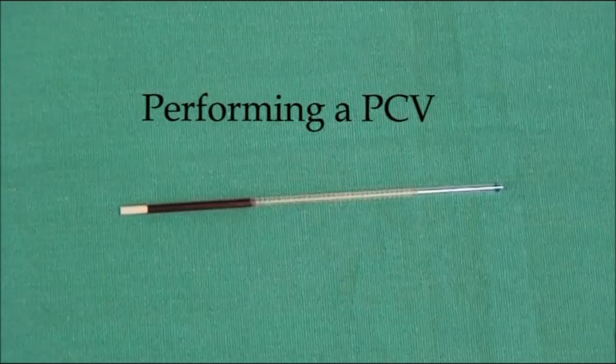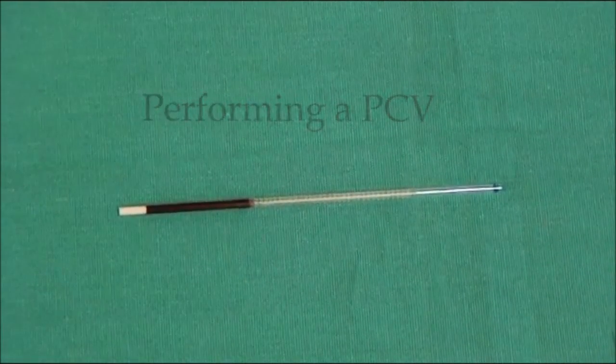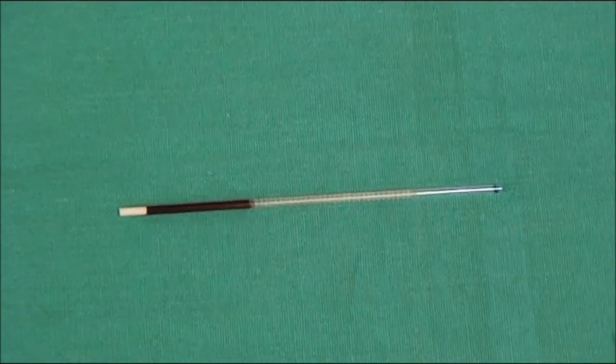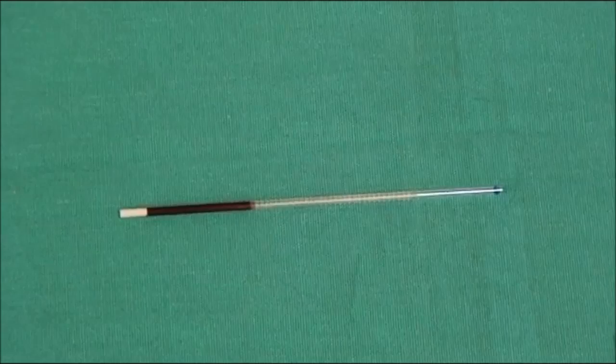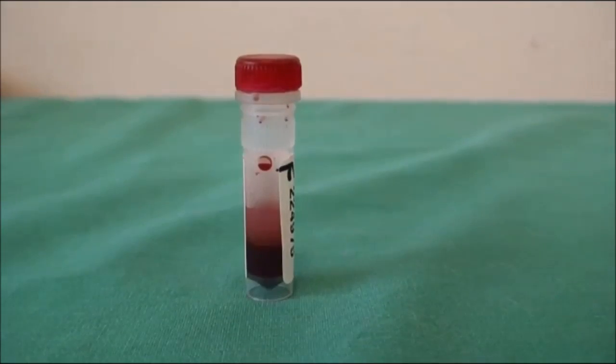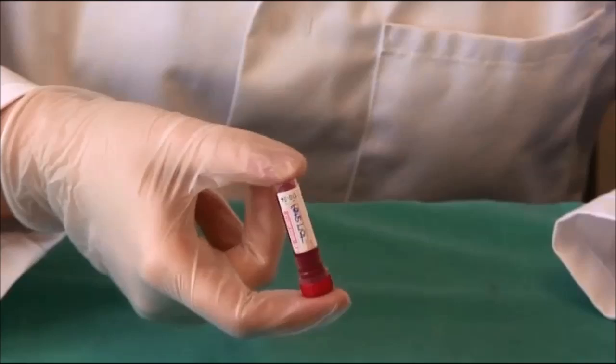A PCV or packed cell volume using the hematocrit method is used to make a rapid assessment of the number of circulating red blood cells. It is safe practice when handling blood to always wear protective gloves. To counteract the fact that blood cells will naturally separate into layers, the EDTA blood sample is adequately mixed by inverting the tube at least 10 times.